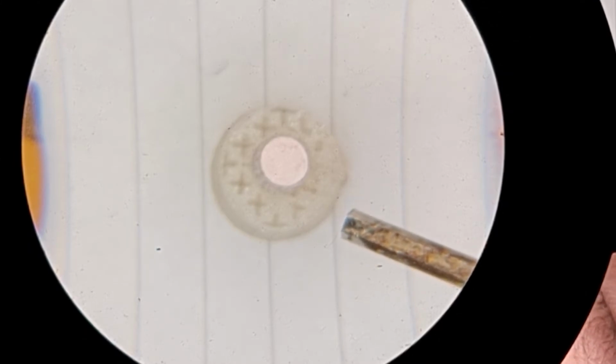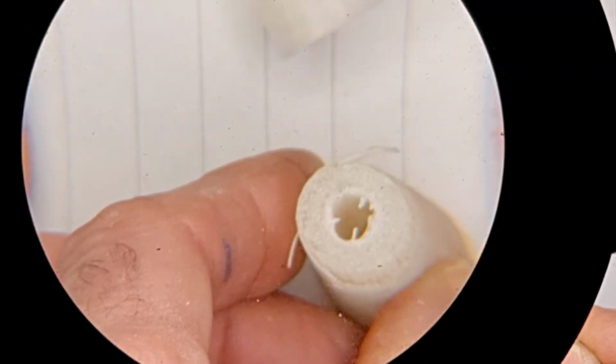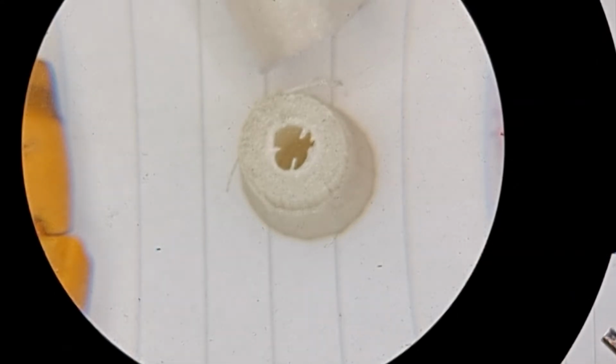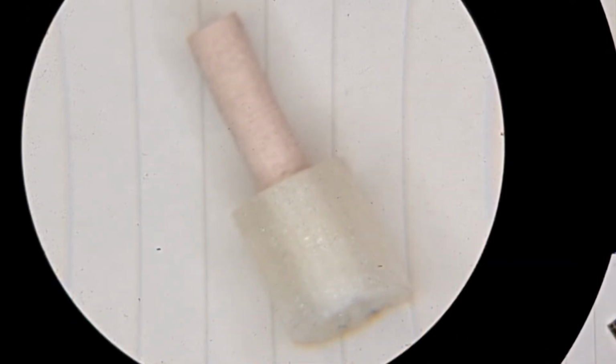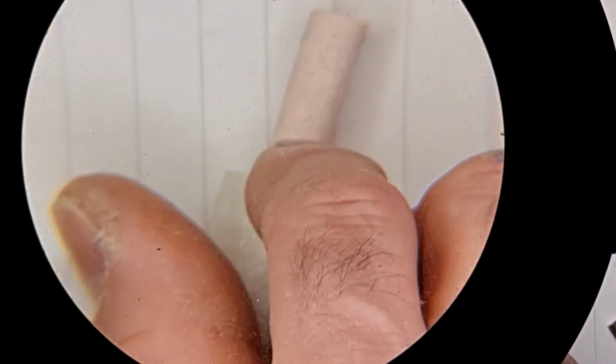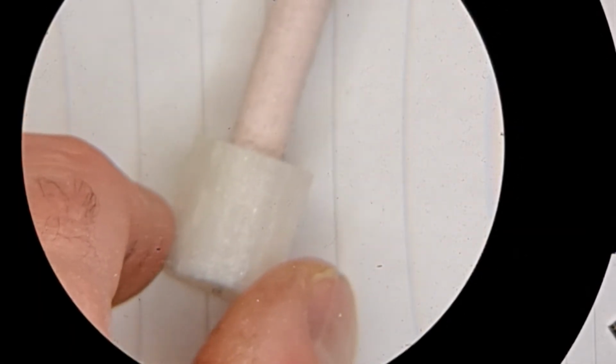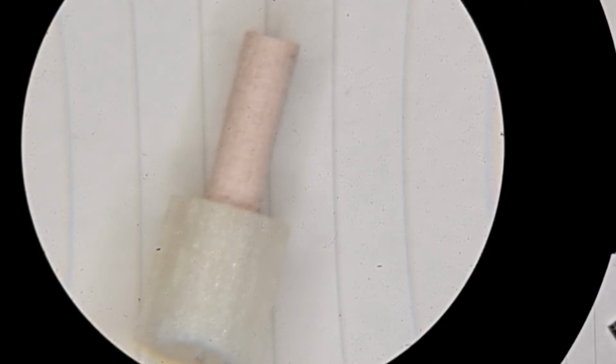This one was okay. I think this was around 65% infill. What I've gone for to actually start off with is a 90% infill, which looks something like that, because that gives a lot more spring resistance, just so I can experiment to start off with. So that's what it looks like, and of course inside, as I said, we've got a silicone or caravan glue damper in there. So basically what I did was print the outer unit up to 90%, allowed for a hole here, and then infilled the unit with silicone. I made sure on the latter prints that there was enough of a thickness of a wall inside the print to make sure that that silicone was held within the plastic flexible print.